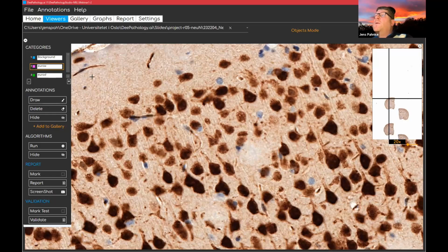So now we use the darker one. We go on this one, and I will teach the software. Let's say for this dark neuron here. That's one. Number 2. This has anatomically nothing to say now. I just choose 2 different objects just to show you how it works. These are all the same neurons. They are just in a different layer depending on the cutting. That's why they are dark or not so dark. So we have this. We also take the dark one here.